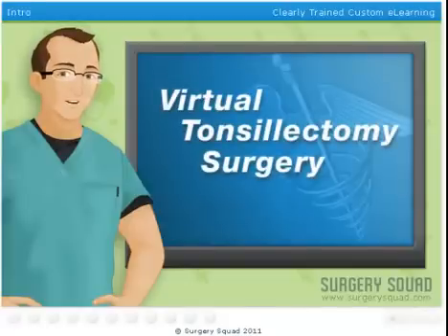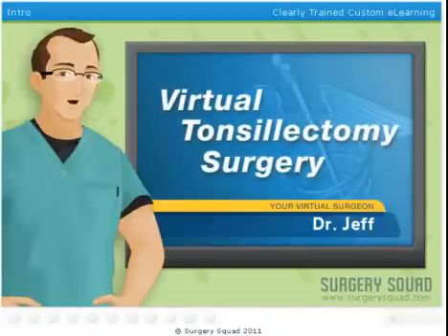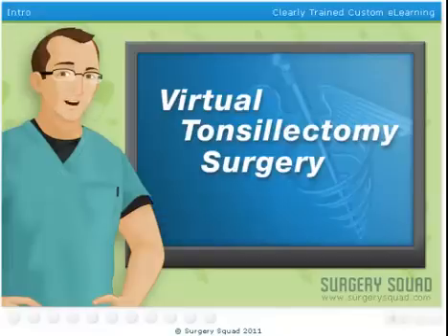Welcome to Surgery Squad's Virtual Tonsillectomy Surgery. I'm Dr. Jeff. Today we'll be removing a young man's tonsils.